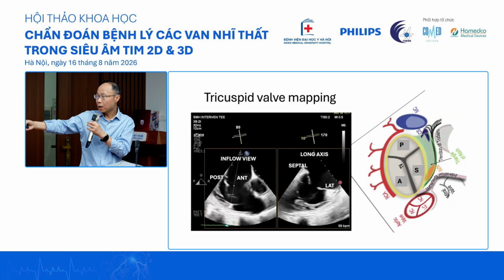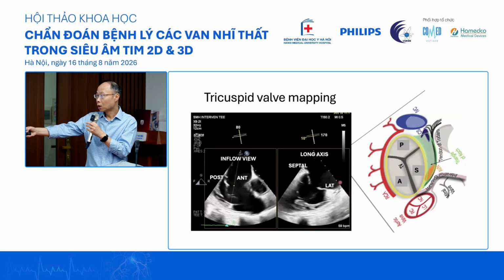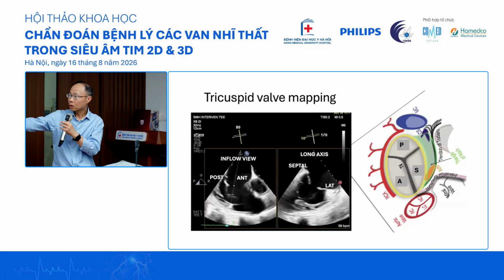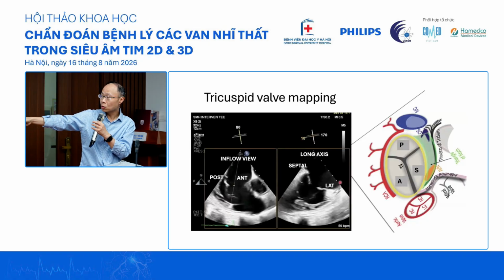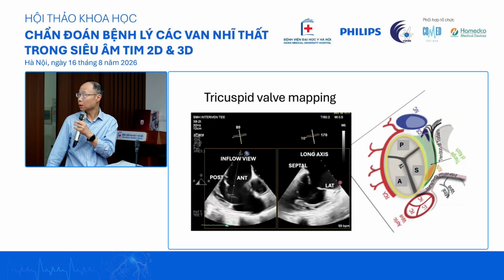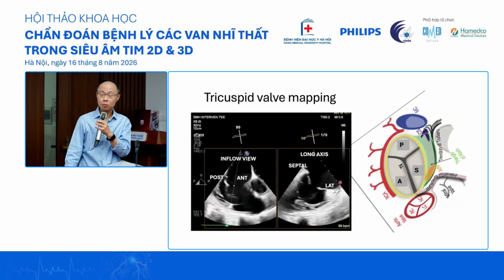So you kind of dial, and then you get what is very similar to the focus view on the transthoracic echo. When you do that, you are aligning yourself straight down AP. So you're quite certain that this is A, this is P. All the more so when you see the outflow tract, or sometimes you can see the aortic valve over there. Once you see that, you know that you're quite certain this is AP.